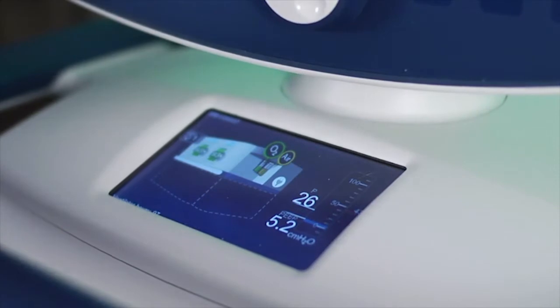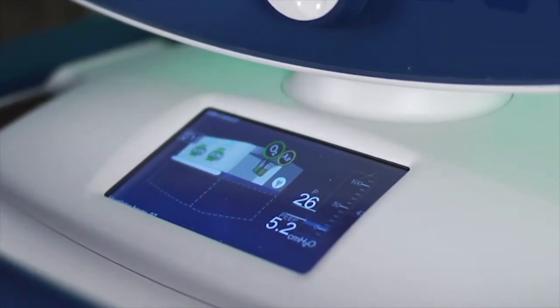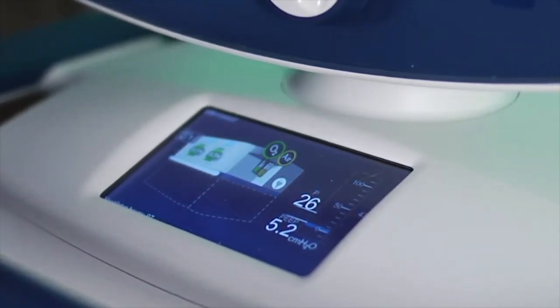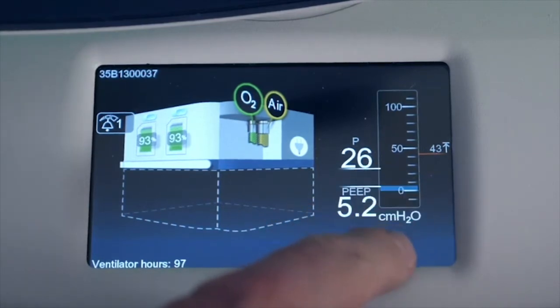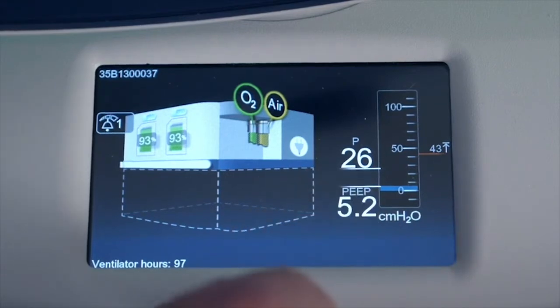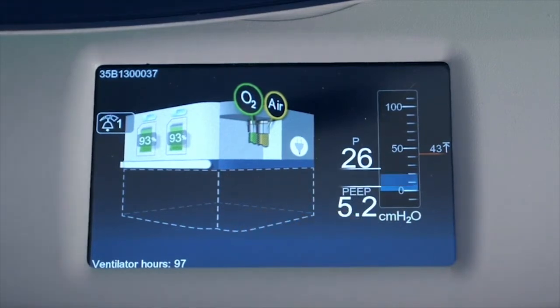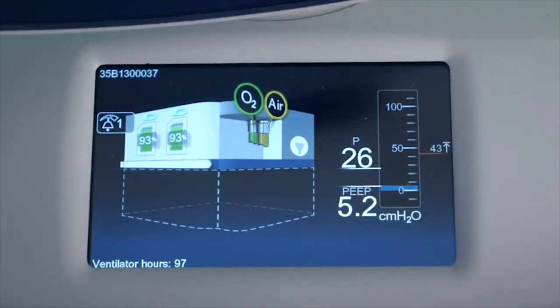Now I want to talk a little bit about the status display. On the status display, you'll see a number of pieces of information. Starting from the right-hand side, you'll see basically the rise in pressure. Here is a secondary display of peak pressure of 26, PEEP of 5.2, and you can even see the high pressure limit set over there at 43.